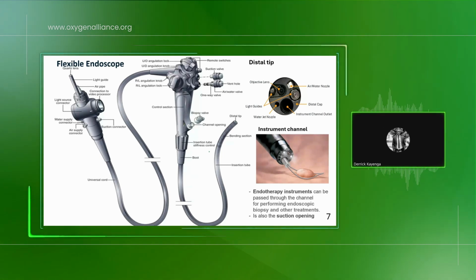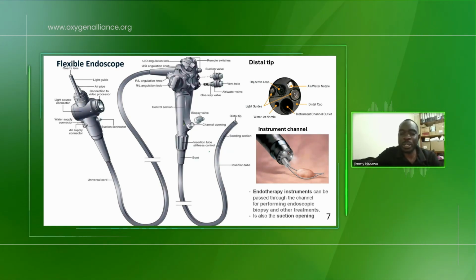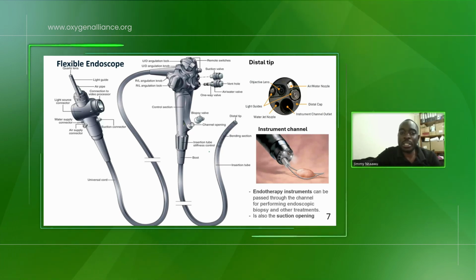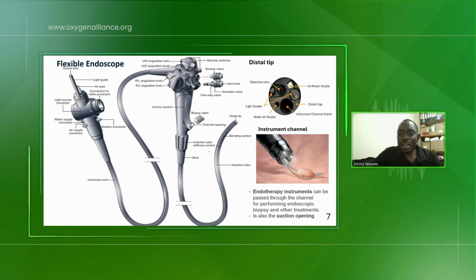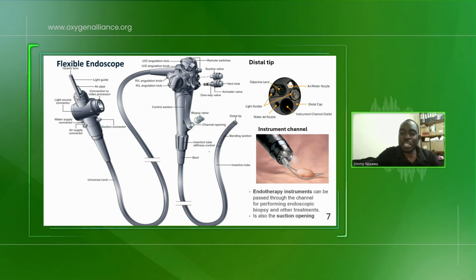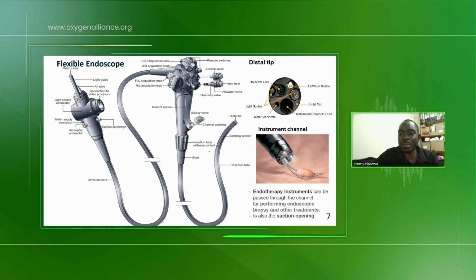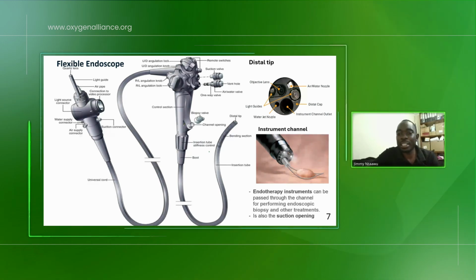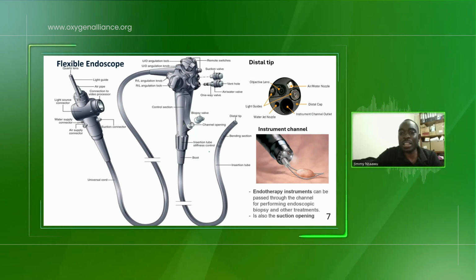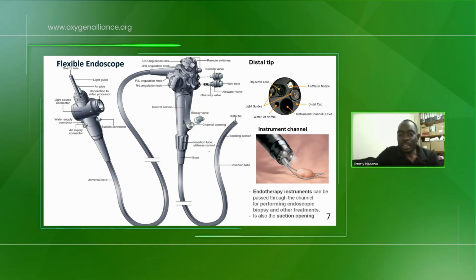Now you're going to have to check the boards that control the camera, the boards in the processor that control the image. Another way you can confirm if your processor really has a problem, you get another scope and try to do the same. If it behaves in the same manner, just know the problem is with the processor, and inside the processor, it's the boards that control the image. All right, I hope that helps.